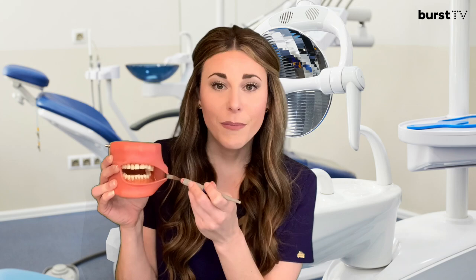The most common and probably the least scary dental instrument is the dental mirror. We primarily use the mirror for retraction and indirect vision. I have a mouth model here to help demonstrate what I mean. By retraction, I simply mean we're going to use the mirror to help pull back the cheeks for better access to areas that are hard to reach.